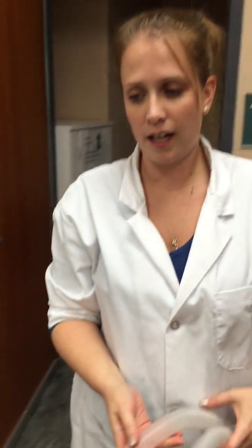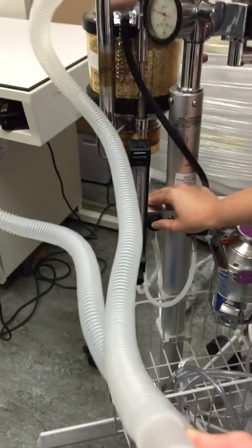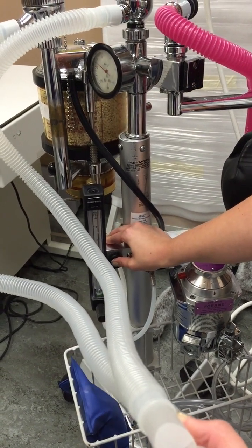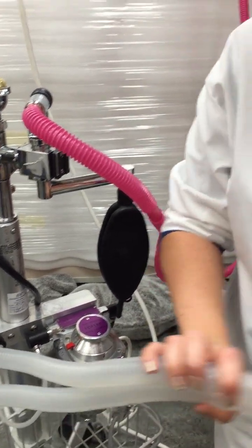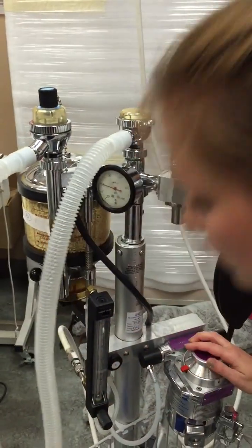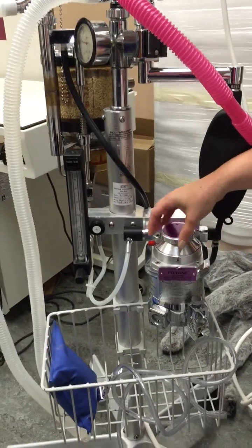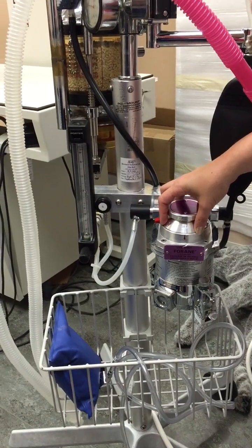So if you have a patient that has an anesthetic emergency, such as a cardiac arrest, you would remove the circuit from your patient, plug the end of the circuit, use the oxygen flush valve to remove any residual isoflurane within your circuit, and empty it to come out your scavenge. And then you have 100% oxygen going to your patient that's going through the emergency. The reason you do this is because the oxygen flush valve completely bypasses the vaporizer. So when you push that, it does not take any isoflurane to your patient. It just takes 100% oxygen.